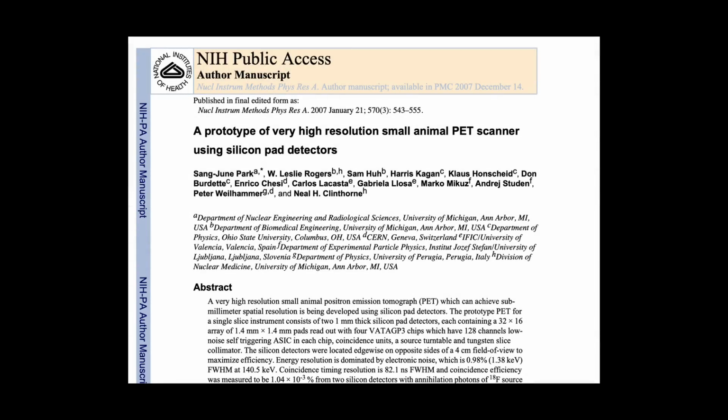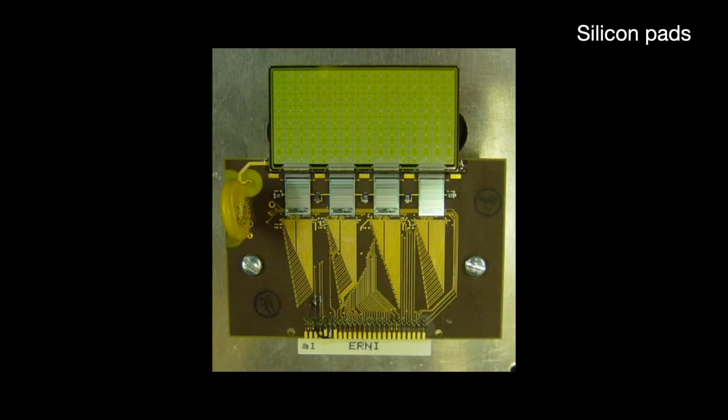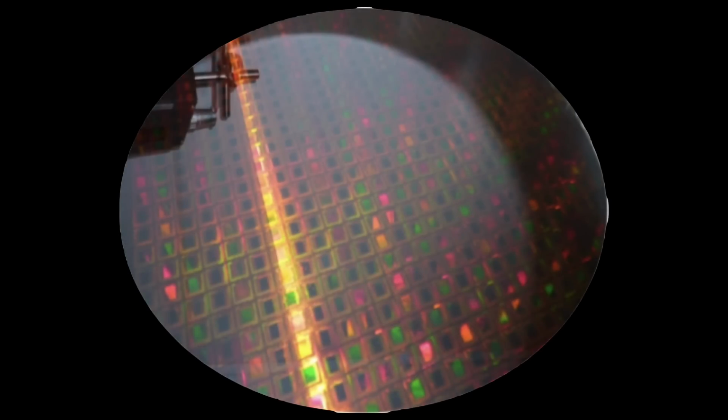Scintillator-based PET scanners remain the standard in the industry. However, people continue to experiment. There has been interesting research into silicon pad-based detectors for PET scanners. Prototypes have been manufactured, and those seem to work. However, there are many technical challenges to overcome. First, they would be very technically complicated to build. And second, they would probably not work as well as traditional crystals. The best their image quality might be suitable for would be preclinical scans. This is because silicon's photoelectric fraction is nowhere near as high as scintillators like BGO. BGO's is 43%, while silicon's is less than 1%, which forces us to make the pads thicker to compensate.